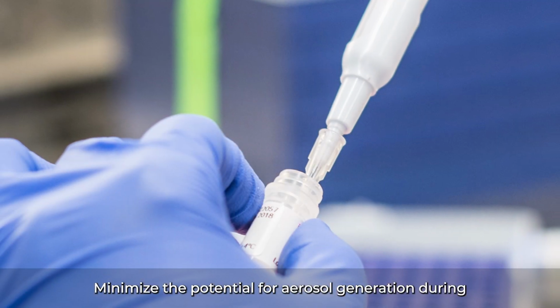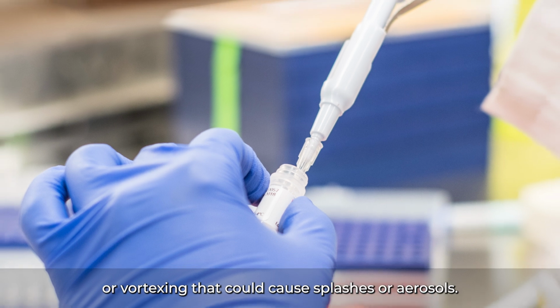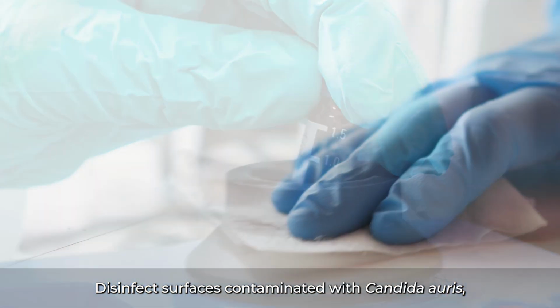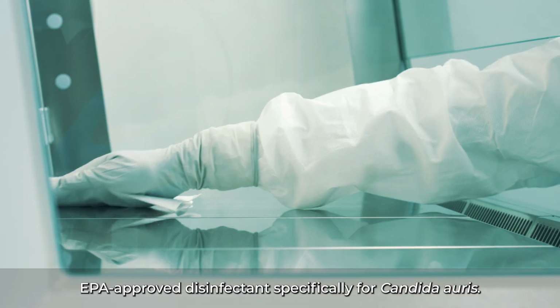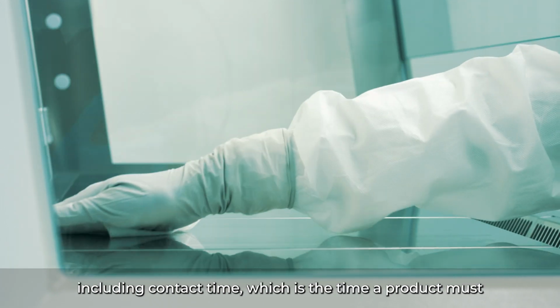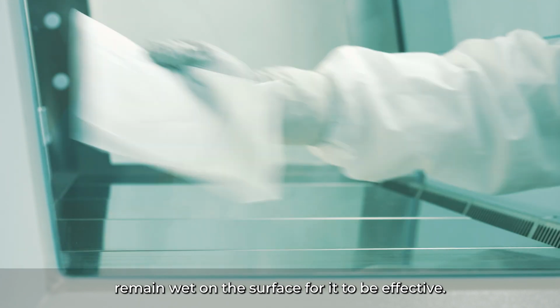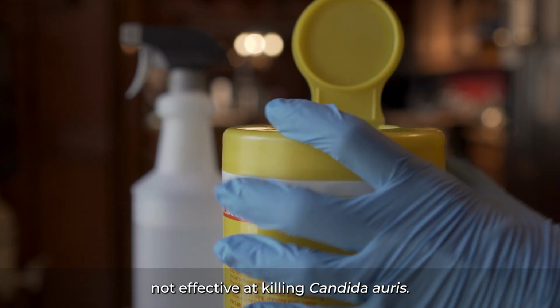Minimize the potential for aerosol generation during sample preparation by avoiding vigorous pipetting or vortexing that could cause splashes or aerosols. Disinfect surfaces contaminated with Candida auris, including the biological safety cabinet, with an EPA-approved disinfectant specifically for Candida auris. Follow the label directions for Candida auris carefully, including contact time, which is the time a product must remain wet on the surface for it to be effective. Note, quaternary ammonium compounds are not effective at killing Candida auris.